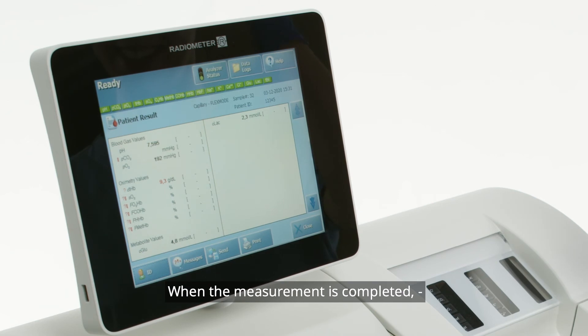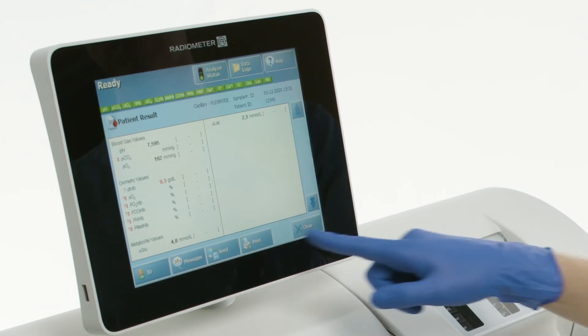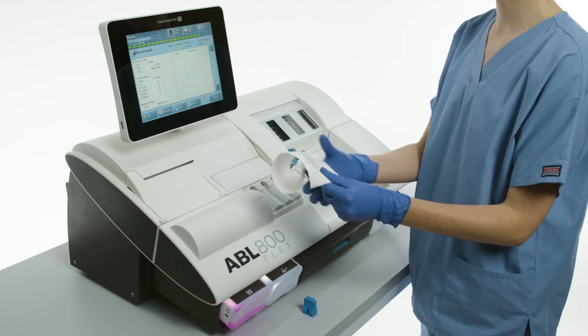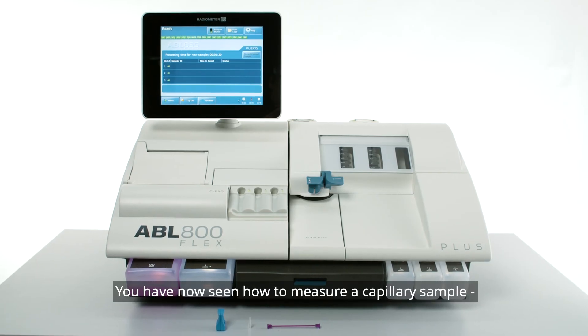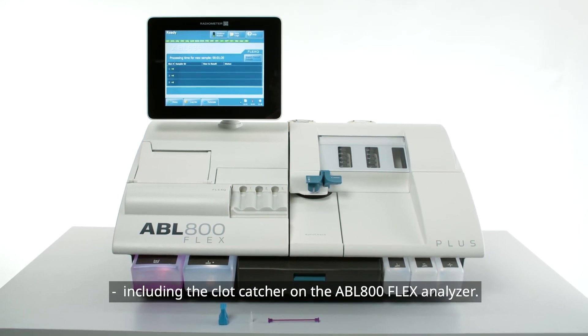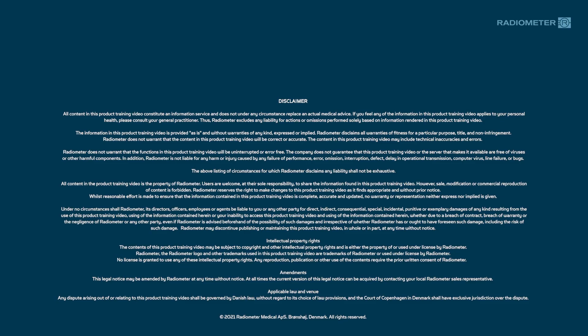When the measurement is completed, the patient results screen will appear automatically. You have now seen how to measure a capillary sample, including the clot catcher, on the ABL 800 flex analyzer.